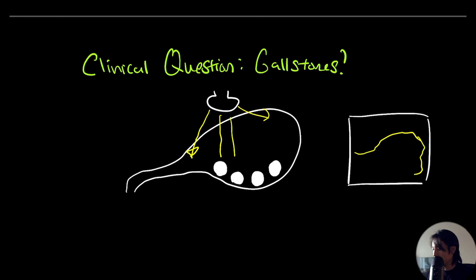And you'll notice it'll basically scan the stone and get the top edge of that stone. And so you can imagine the machine will create that figure here. And it says, yeah, I see some stones. But when it tries to shoot an ultrasound beam behind it, that stone is so dense that it blocks it and shoots it right back up. And so ultimately, the area behind the stones is invisible, and you'll create these dark shadows behind that stone.